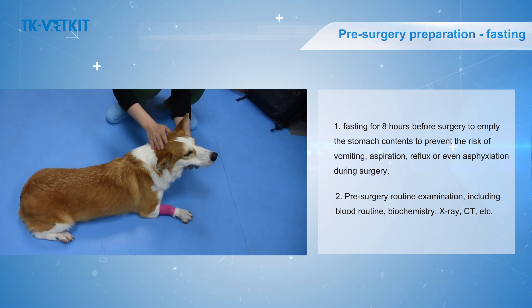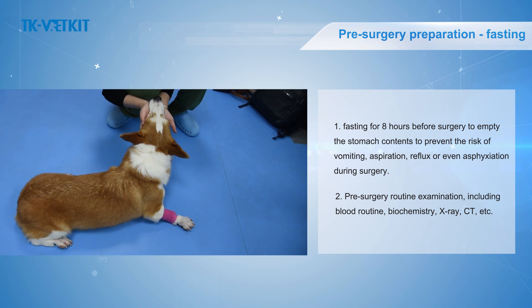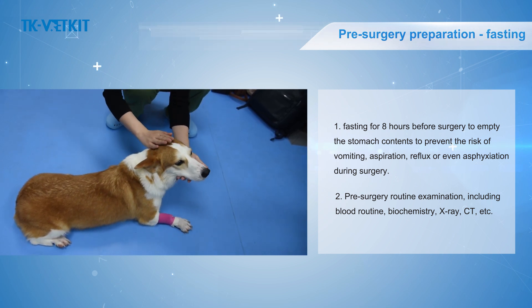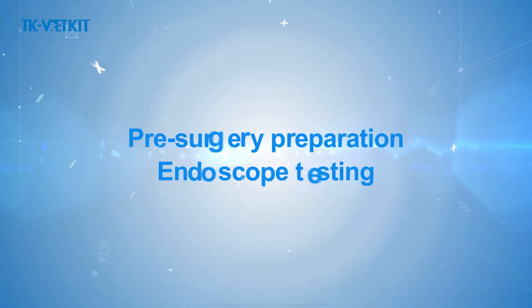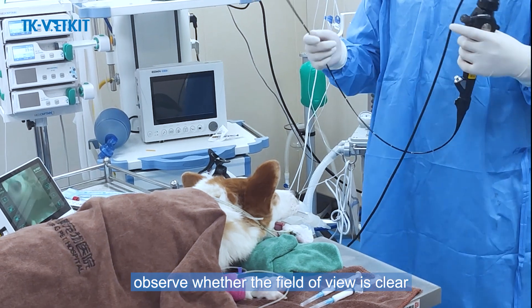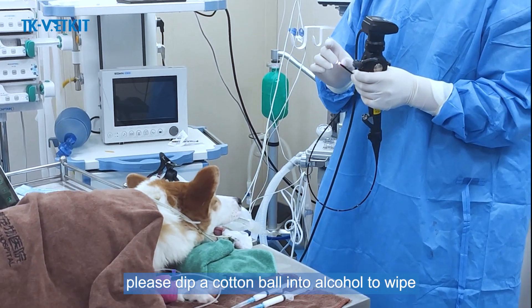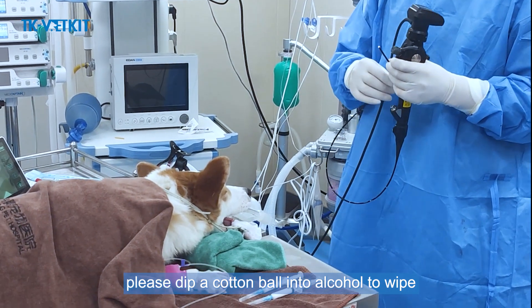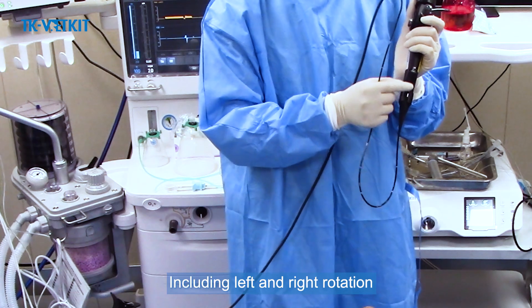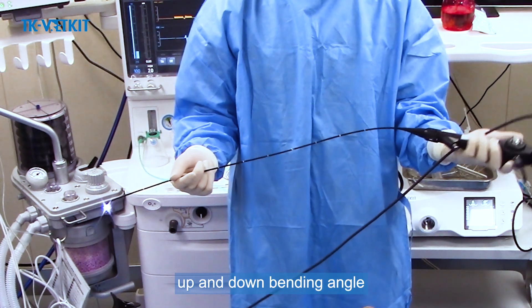Pre-surgery routine examination includes blood routine, biochemistry, X-ray, CT, etc. For endoscope testing, observe whether the field of view is clear. If the field of view has been blocked by foreign objects, dip a cotton ball in alcohol to clean it. Check whether the endoscope functions are normal, including left and right rotation, up and down bending angle, and suction button.